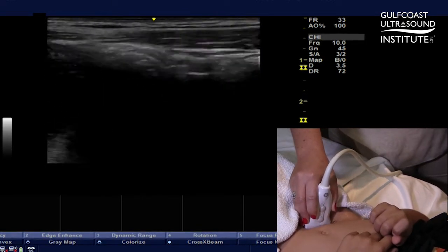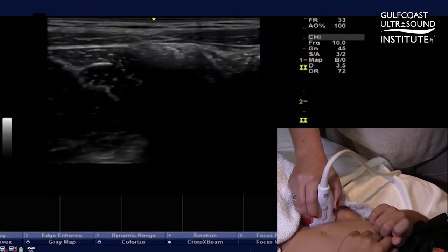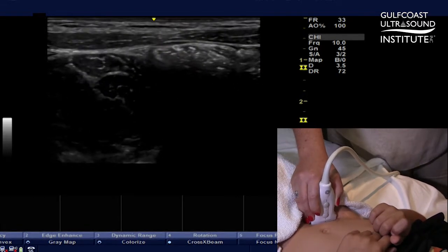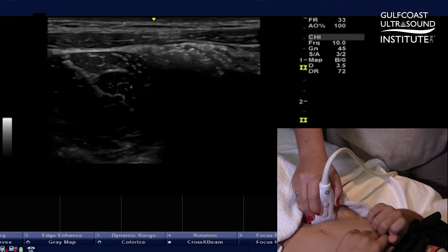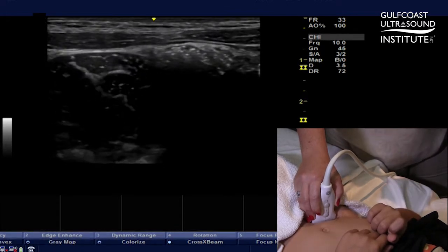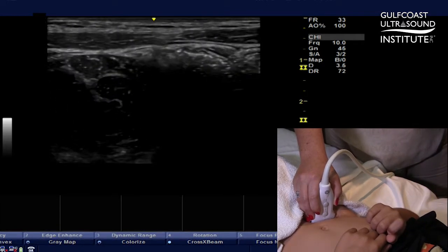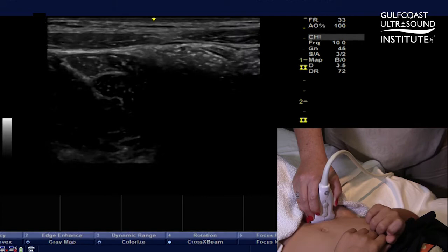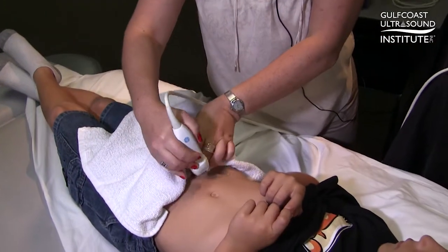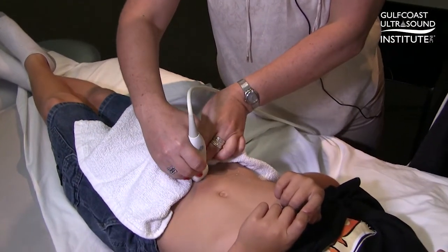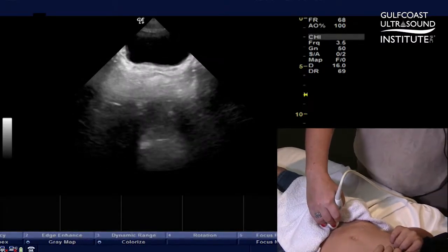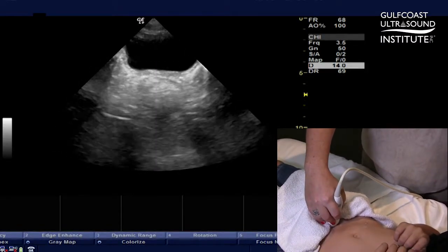I can't compress it, so I can't say entirely that this child doesn't have appendicitis, but I'm actually going to look for constipation now. I'm going to change my probe to the phased array probe and measure the rectal diameter. I'll put the probe just superior to the pubic bone and find the bladder in transverse view.